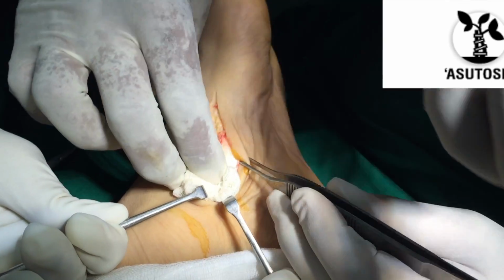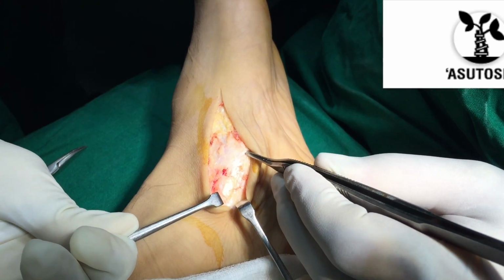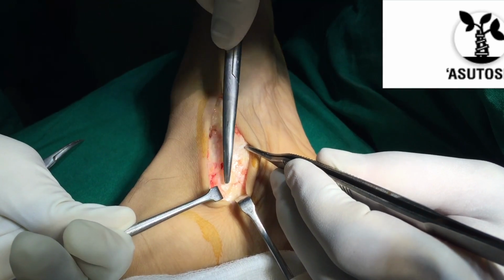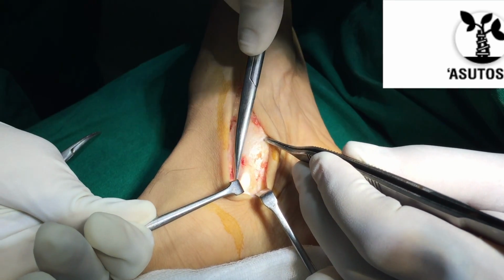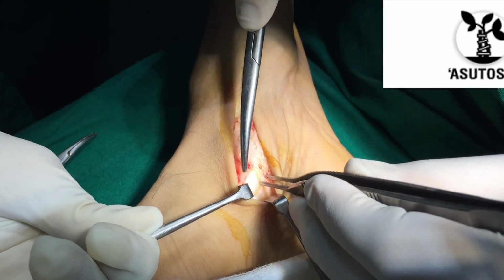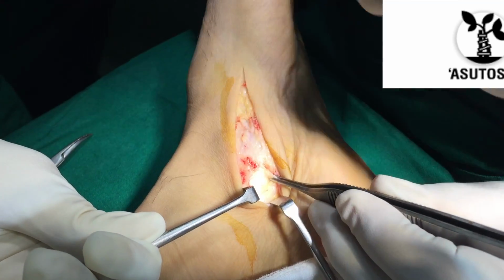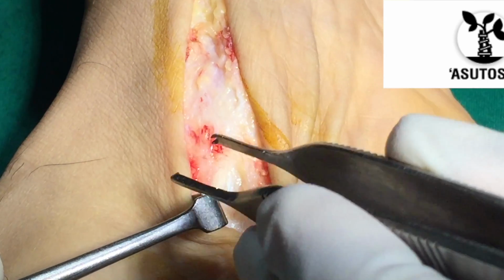So we have made a nick into the posterior tibial tendon sheath, and basically extending with a scissor proximally, and then we would be going distally. Thereby we will be just splitting the tendon sheath to reach the posterior tibial tendon.